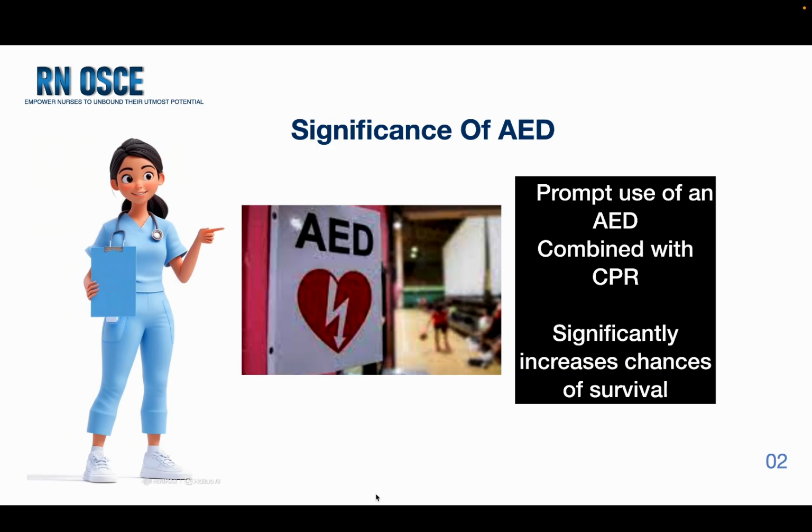AEDs provide voice and visual prompts, allowing even non-medical persons to perform life-saving interventions before emergency services arrive. It is accessible, available in public places, hospitals and ambulances, improving response time during sudden cardiac arrest.